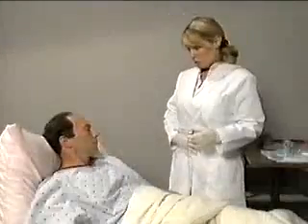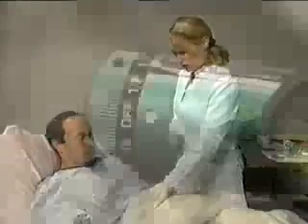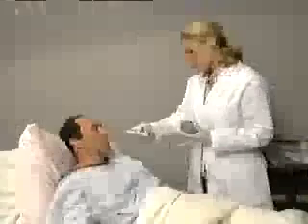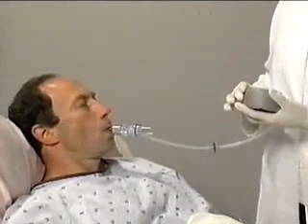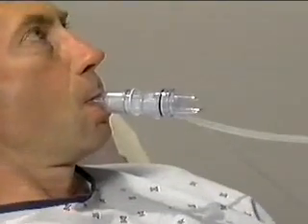To begin, instruct the patient to relax while performing diaphragmatic breathing. Set the flow rate to 5 liters per minute on the wall air or oxygen flow meter. Place the mouthpiece in the patient's mouth and instruct the patient to breathe easily against the pressure from the device. Be sure that the patient maintains a tight seal on the mouthpiece during therapy. Recommend the use of a nose clip if necessary. If using a mask, apply the mask tightly but comfortably over the nose and mouth.